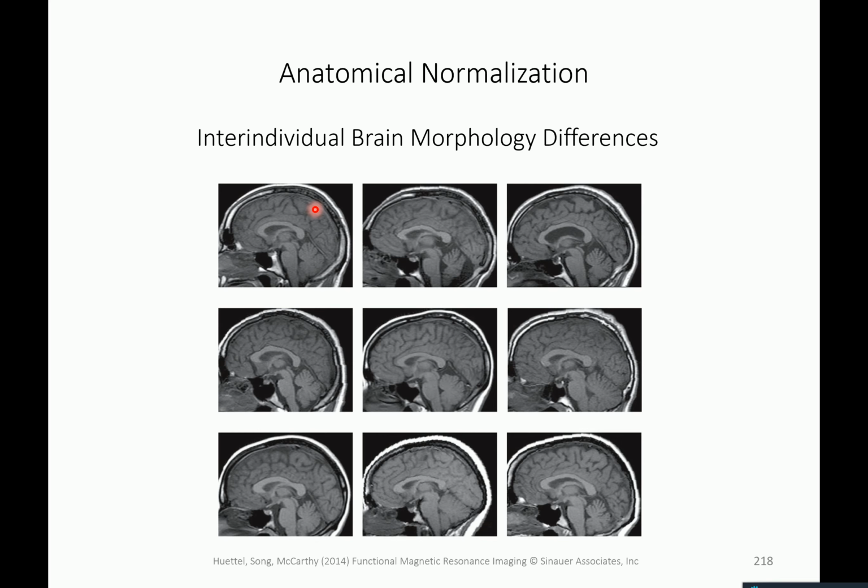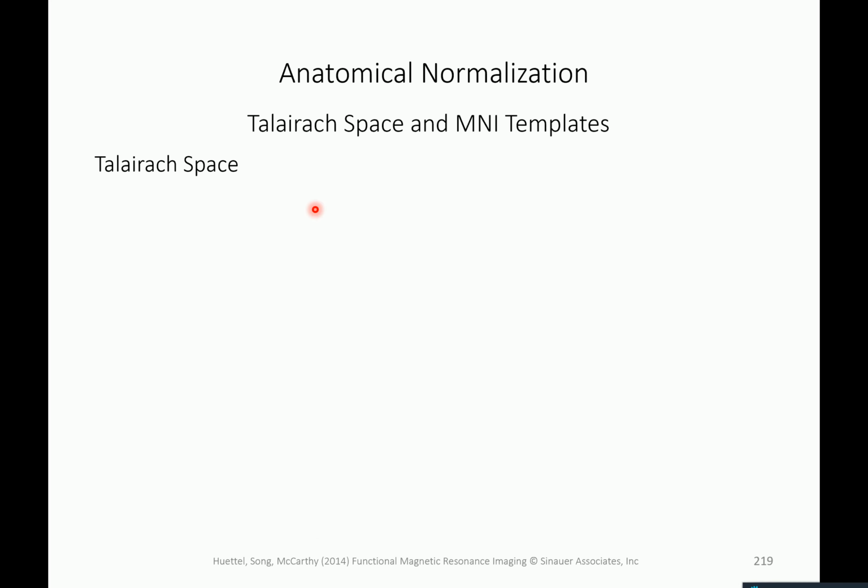This essentially means that you want to do away with inter-individual brain morphology differences if you're doing group analysis.